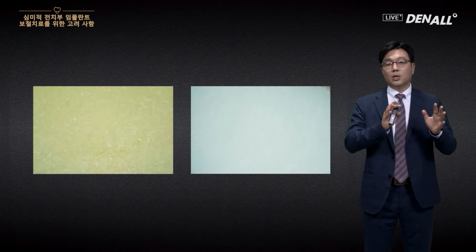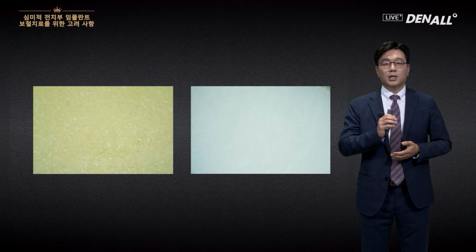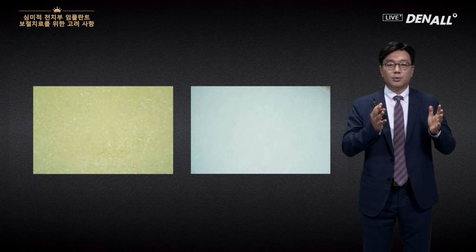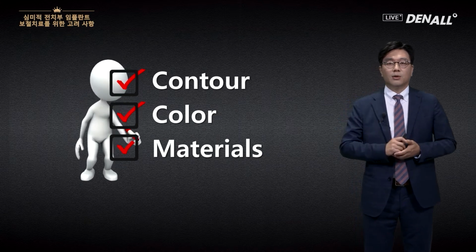If you look at it carefully, on the left, it's the built-up ceramic. On the right, is the press ceramic. On the left, the built-up ceramic has pores which interferes with the cleansing and cause irritation to gingiva. You need to consider that if it is located under gingiva.